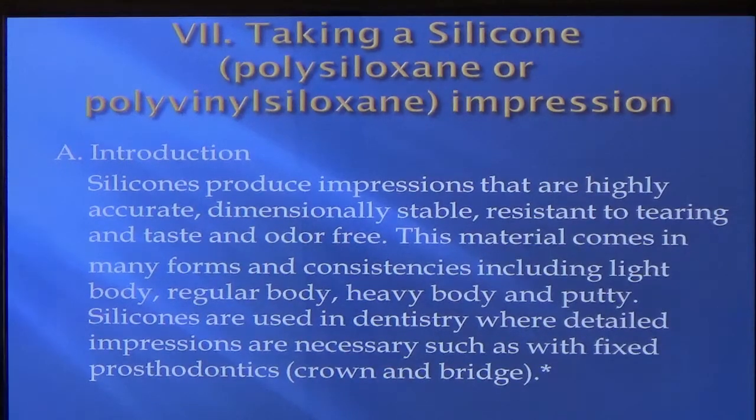Some of you who have been here for the shadowing have seen us using the CEREC machine. Now we don't need any of this because we use the CEREC. It's a digital image. Alexis, who else has been here while I've been using the CEREC? Just Alexis.